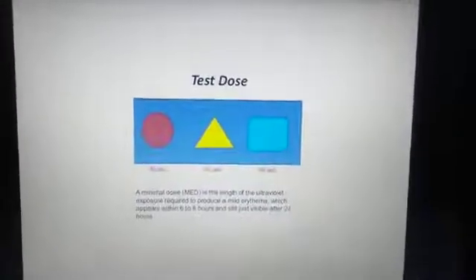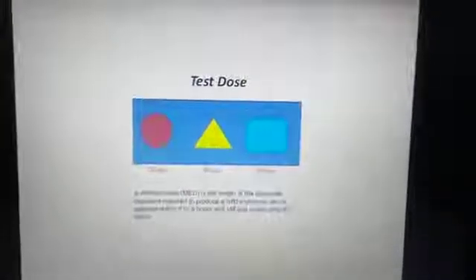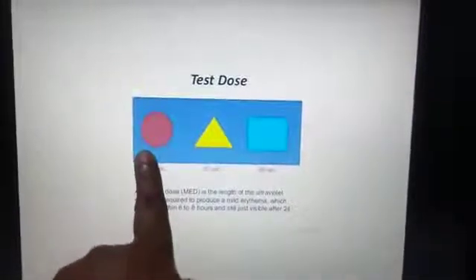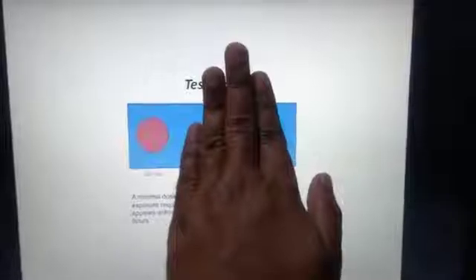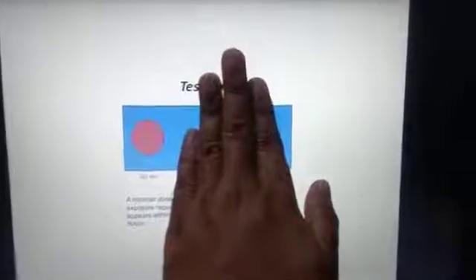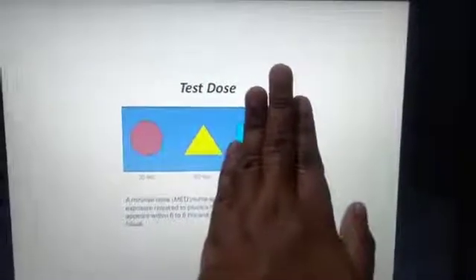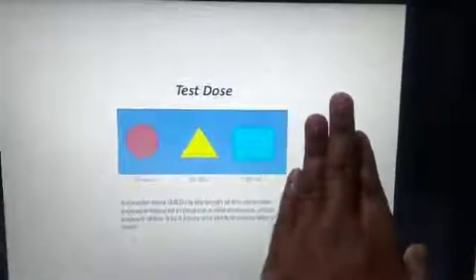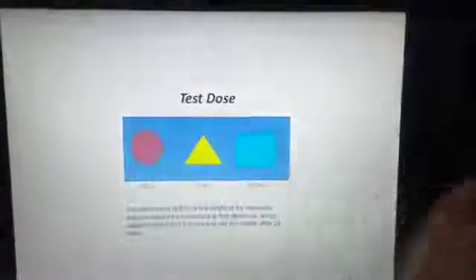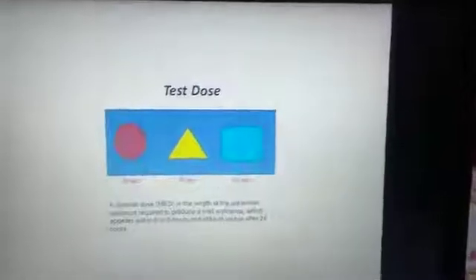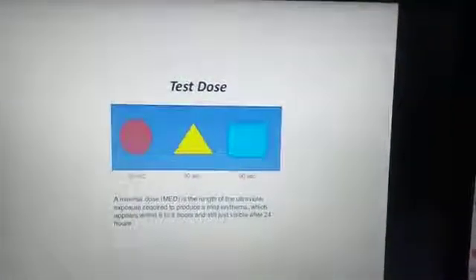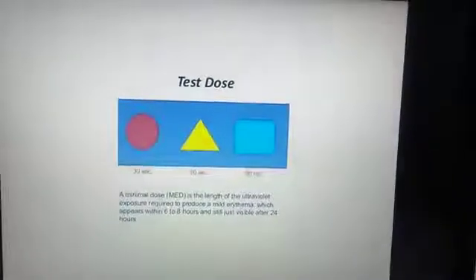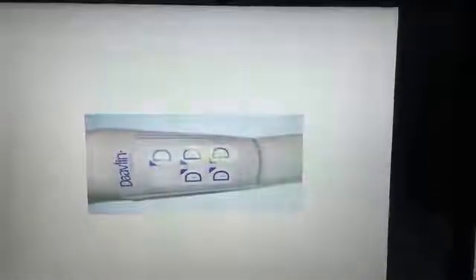Suppose you are exposing this for 30 seconds, then you have to cover these two with a linen cloth or something. Then suppose the test duration is for 15 to 20 minutes, you expose this area again for 60 seconds exposure, and then 90 seconds of exposure. You do it in this way. This can be done with a linen cloth or with a cardboard box also.